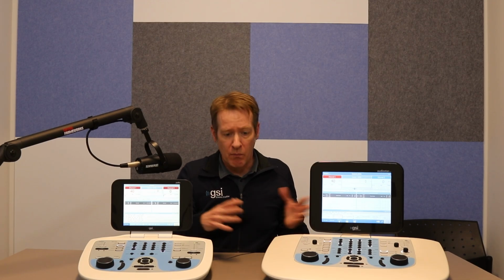Now, another feature here is going to be called auto advance, and that is going to be more towards the left side of your options. And with this option, what we can do is we can break the score counter from the auto advance. And this is really important for something like what we have up here, which is the AZ Bio sentence test. With the AZ Bio sentence test and other tests like it, you have multiple target words within the same sentence. So if I was to have, like, say, one of the other autoplay options on, if I hit correct, it's just going to mark one correct score for that sentence.